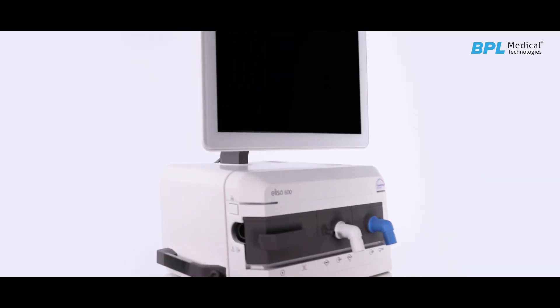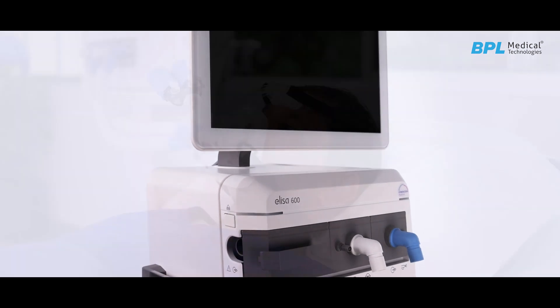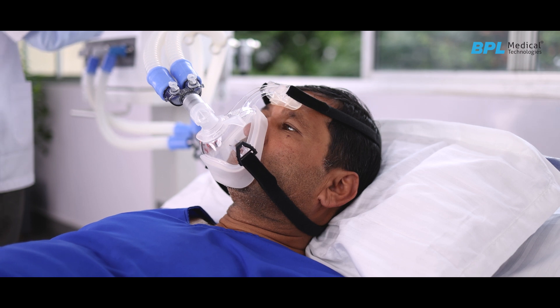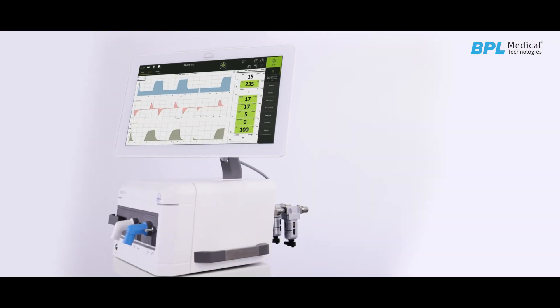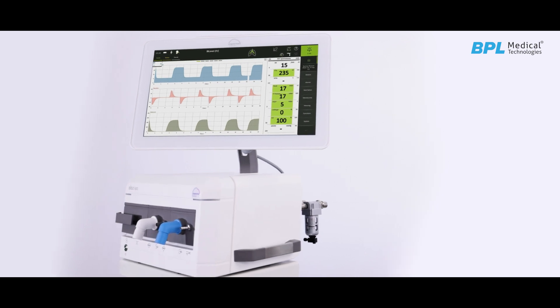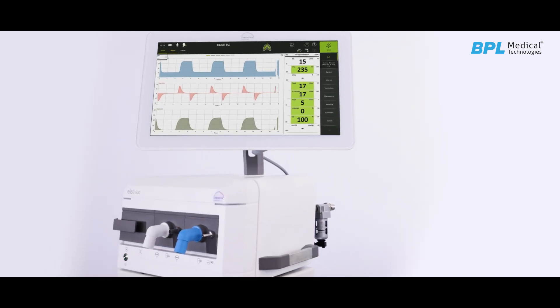ELISA 600 represents an innovative ventilation platform for present and future medical applications. With its state-of-art 18.5-inch touch screen, it enables wider viewability of patient analytics.